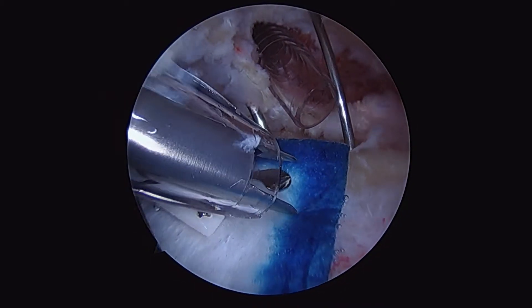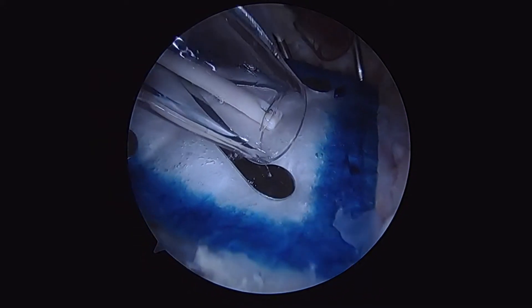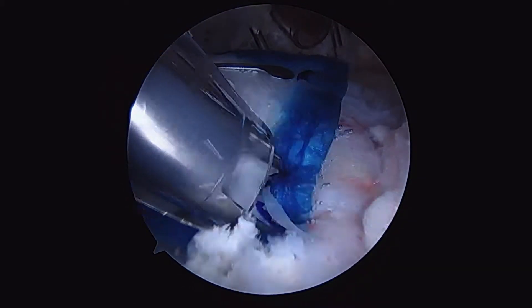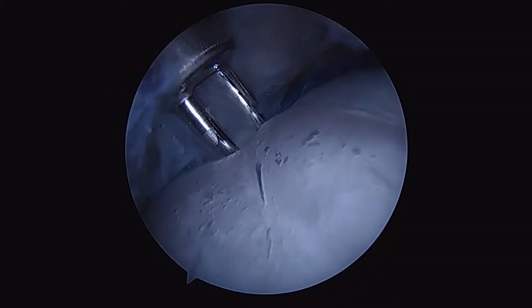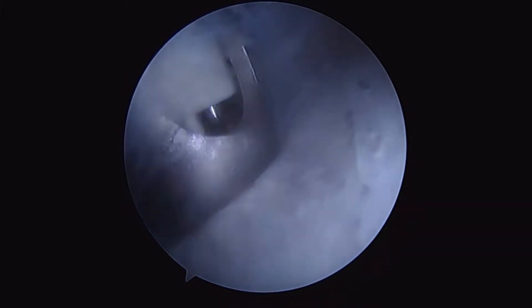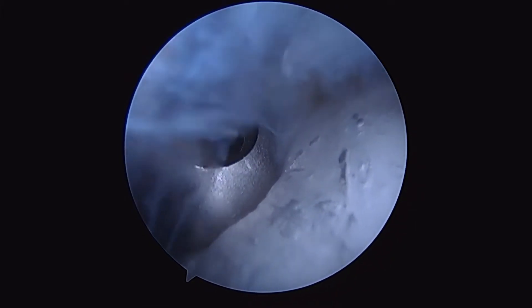We'll use our absorbable staples to secure our position anterior and medial, and then we'll use our non-absorbable staples to secure ourselves laterally. Here we're down over the lateral edge of the humerus — we'll insert the non-absorbable staples. We've got excellent compression and position of our first graft.